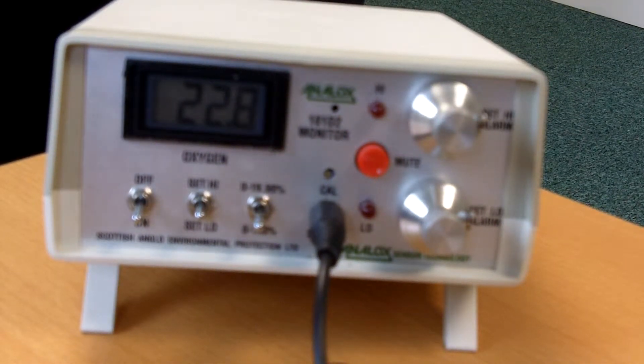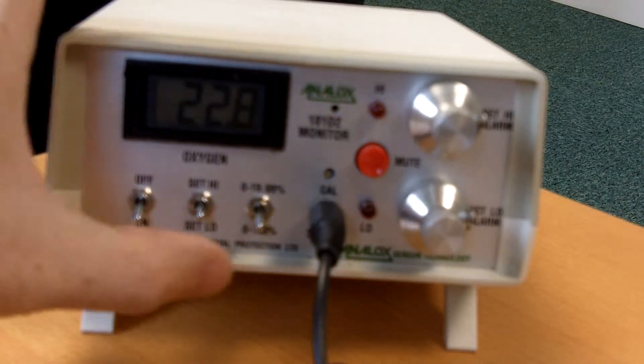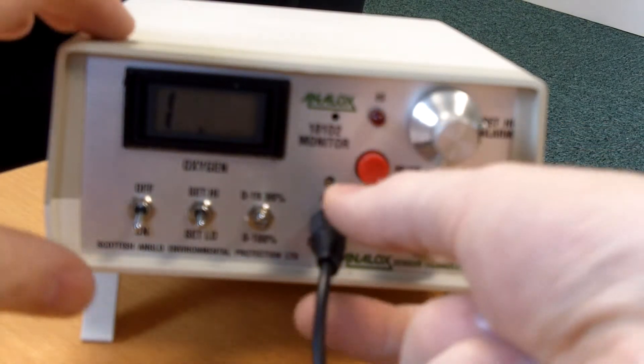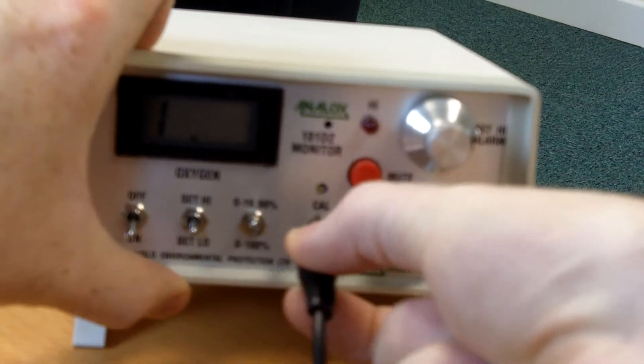Fresh air calibration of an Analox 101D2 monitor. To zero check the unit, you need to select the 0 to 19.99% range using the toggle switch, then remove the jack plug sensor.